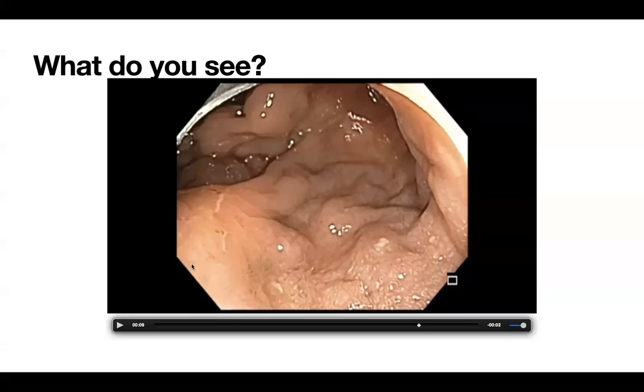Okay. So I actually need to make a couple of points. I had a little bit of a struggle to define this lesion well because the colon, the rectum did not distend well. He's an older guy, 70 years. The second one is, I must say this, I wish I'd put a longer cap. I think you make a very good point.